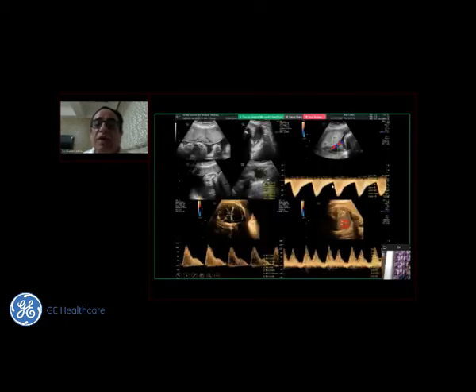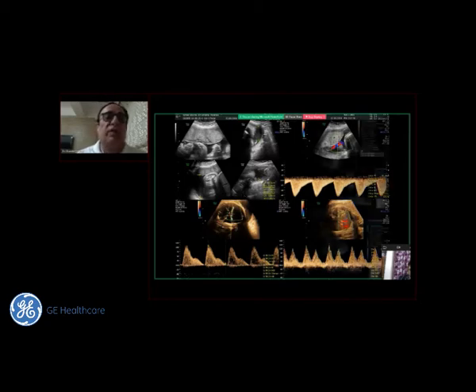Our uterine artery Doppler is normal, and look at the umbilical artery. The PI suddenly drops. MCA suddenly shows absent diastolic flow here, that means cerebral edema. And look at the ductus venosus. Absolutely bizarre. I was scared to see this ductus venosus. In 1 week's time, and the placenta looks absolutely normal. So this is deceptive. And it is really scary, but fortunately we could salvage the baby.